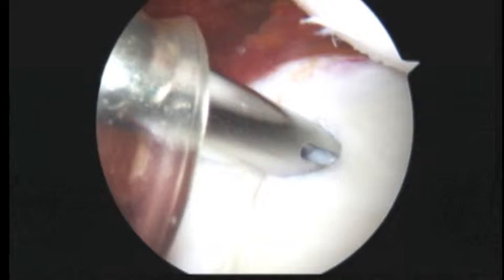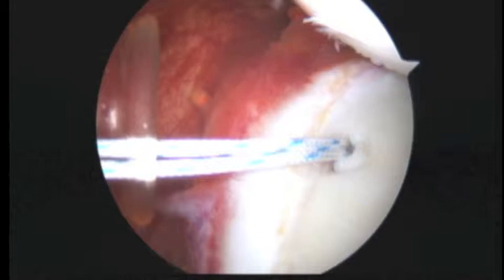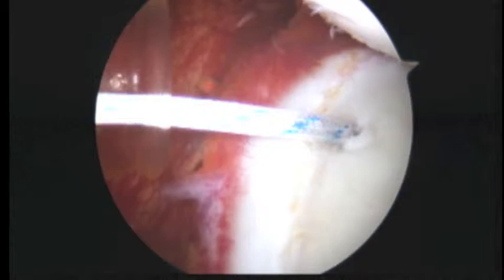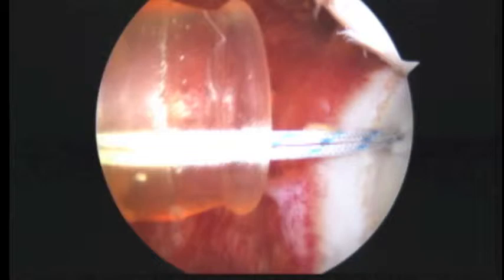Here you can see our guide, and we have a little wire drill that we've already used — now we're just placing the anchor. As we back out, you can see how small that implant is right next to the labrum. One of the keys is you've got to pull back to seat it — and now it's very stable. I don't think we need to roughen up the capsule here because it's already so injected and inflamed. I think that'll heal like gangbusters once we get our suture in.